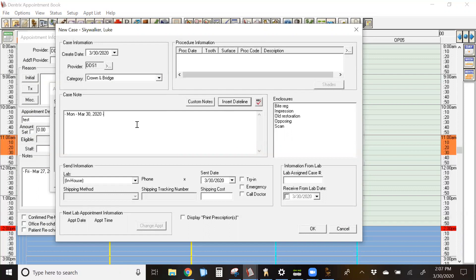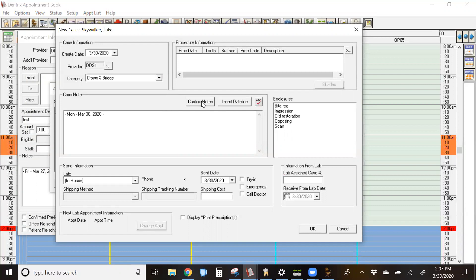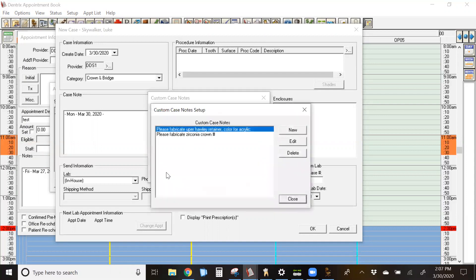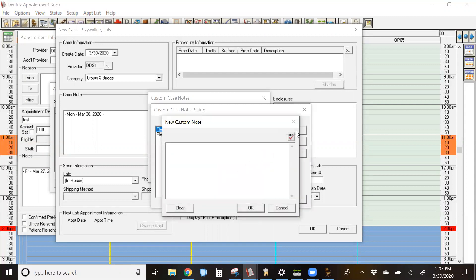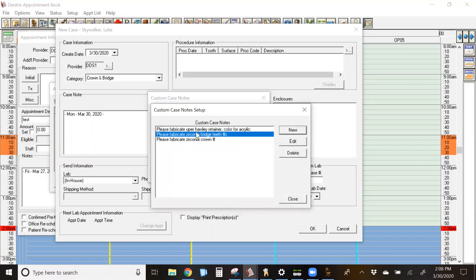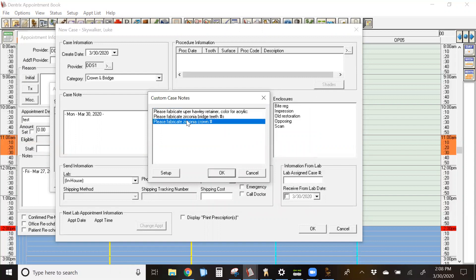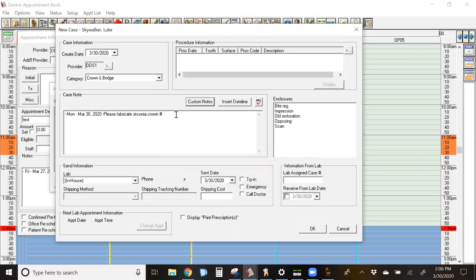I can insert the date line and type my notes to the lab. However, you can use custom notes. If you click on custom notes, you can create templates to use for yourself for the future so that you don't have to type it each time. To add a new template, simply go to the setup button in the lower left hand corner of your box, and then in the upper right hand corner, you're going to click new. Type your note and then click OK. It's now an available template for you to choose. To grab it, you're going to click on the template that you want and then click OK.